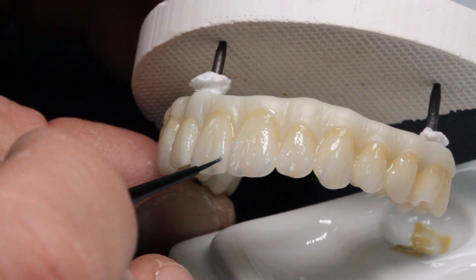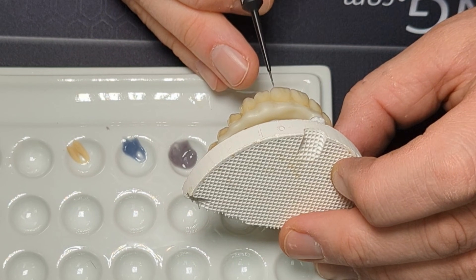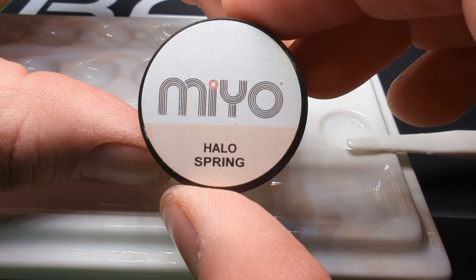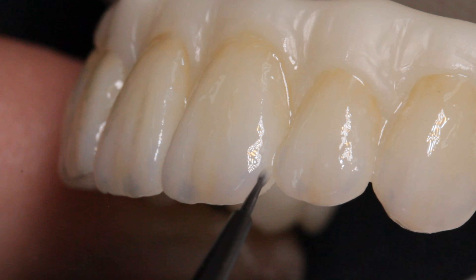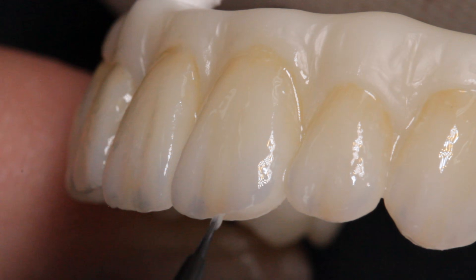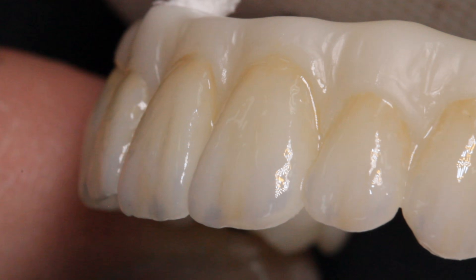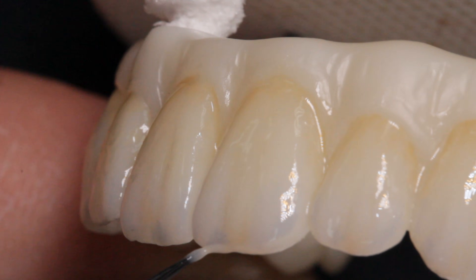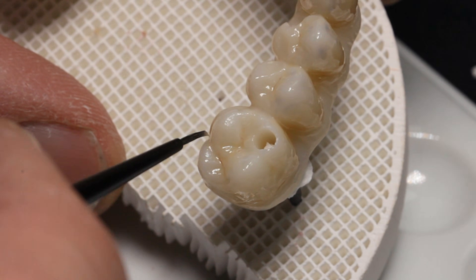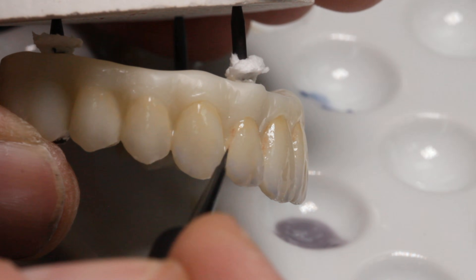Mio is all about creating contrast between dark and light areas, so apply Storm with a little offset at the incisal and not at the outer edge. Halo Spring is a great stain — apply it directly at the incisal edge to create a halo effect. Halo in natural teeth is how light breaks when it enters translucent areas, and Halo in Mio does a fantastic job mimicking that. Fissure is the only powder in the Mio system and can be used in occlusal pits, but also to create discoloration at the neck of the anterior.